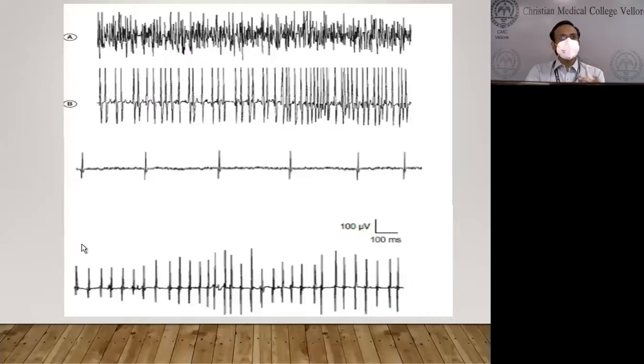So that is that 5:1 ratio. So for 5 hertz we are expecting 1 motor unit. For 10 hertz we are expecting 2 motor units. So in spasticity, if we are very sure that the patient is fully contracting, and we are able to clinically assess that, and in spite of that the patient is only able to activate, and we are only able to see this much, then it is possibly reduced activation and not reduced recruitment.